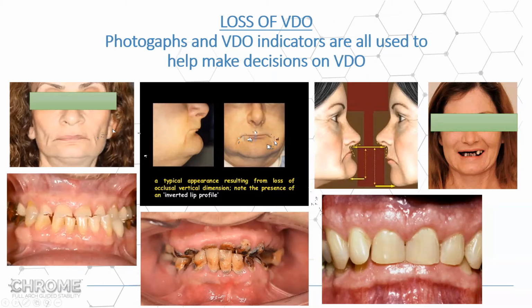And when we look at all this stuff, it's not that we couldn't make a case on what they send sometimes. It's just that with just a little more effort, we can really make a case for a patient that, in appearance, takes some years off of their look. They can function better, they feel better. They pay a lot of money for the case in the first place. So you're just treating the whole patient when you go through these exercises.